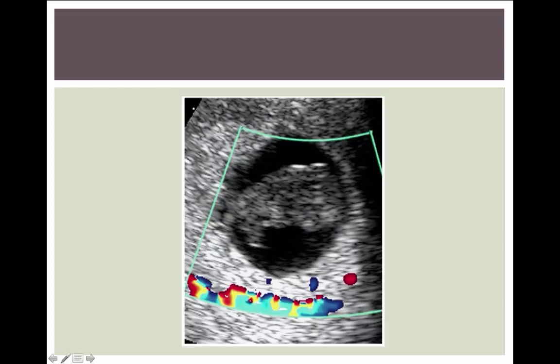The last topic is fetal demise. Being the ultrasound person in your department makes you the expert in diagnosing fetal demise, which is probably one of the least pleasant conversations to have with patients. But it's a necessary conversation. This is an example of a fetal pole - hopefully you've looked with M-mode or stared at this for a few minutes in different planes and haven't found a heartbeat. The only time you should ever put color on a fetus this size is when you're already 99% certain there is no heartbeat. This is just one final way to document the absence of fetal cardiac activity.